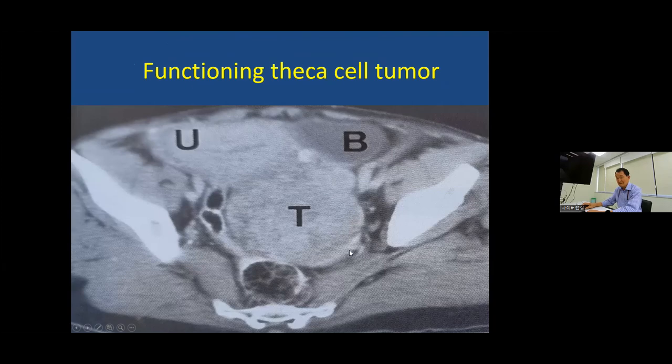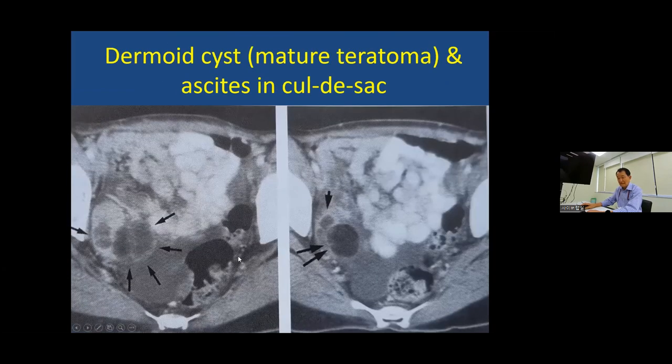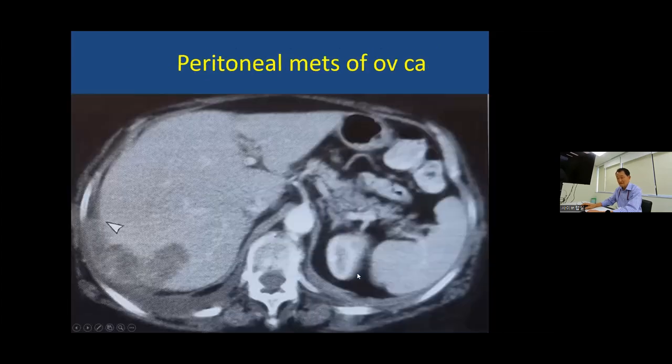In the pelvis of a female, you always look for, as I said, ovarian mass, bladder here, uterus. It's a huge mass. When you see a mass, what is it? Well, the ovarian mass is number one, benign, malignant, whole things. It's cystic, quite a common dermoid cyst or a teratoma. But it could be a malignant tumor. On imaging, you can tell only if certain specific fatty tissue or some hairline makes a suggestion.